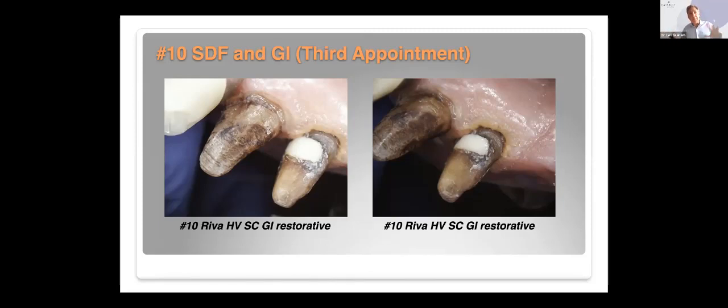So I guess a follow-up, and we'll get Jeff on later, is let's say you did that technique and there's some stain. And now after you've done the stain, if you prepped a little bit of that away, and let's say there wasn't room to put an RMGI or a GI over it, I think for me, the key is I'd probably then want to use a cement that had an RMGI base, such that Jeff had said you really don't bond well to a treated surface, so why not use then an RMGI cement? I'm asking you because I don't know.